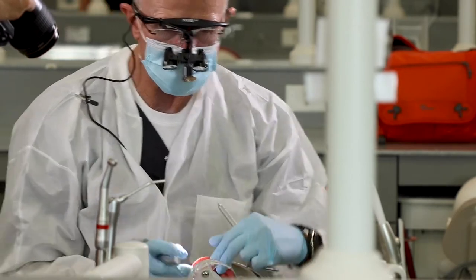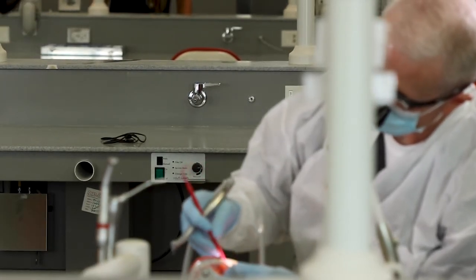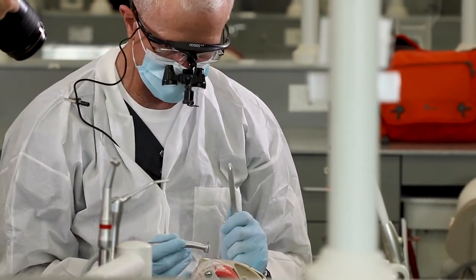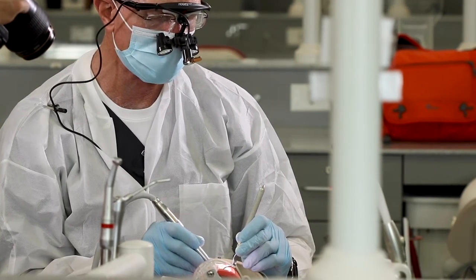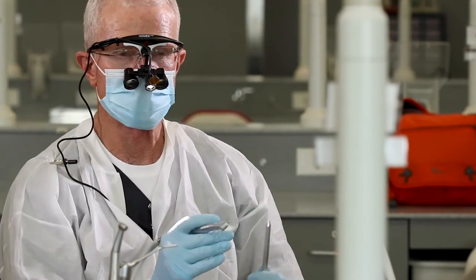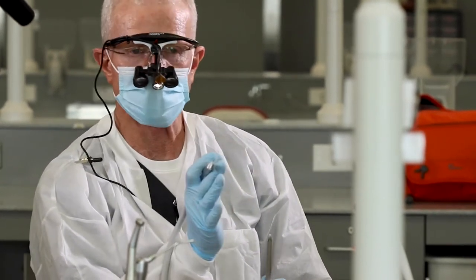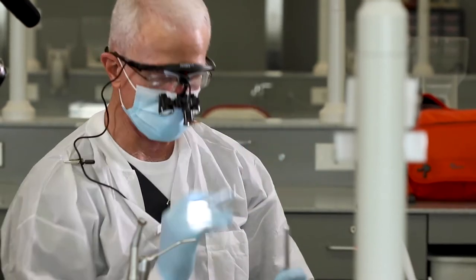Let's check that again and see if we're able to get this red stick in. While it's not a perfect way to measure, it does help. Now it's starting to fit in there on the functional cusp — I can tell that we're getting very close. One of the things that easily happens when we're preparing these upper molars and doing our occlusal reduction is we transpose the lingual groove. That lingual groove is a large groove that goes from distal buccal towards the mesial lingual, and it's very easy to take that groove and straighten it out so it goes more straight lingual — that's not the anatomy of the tooth.